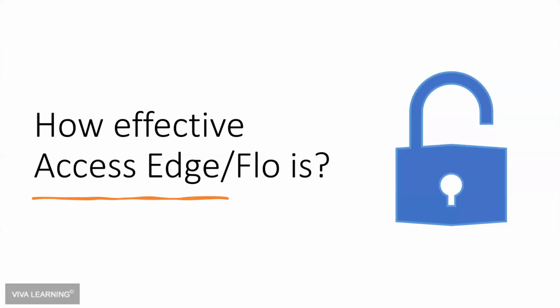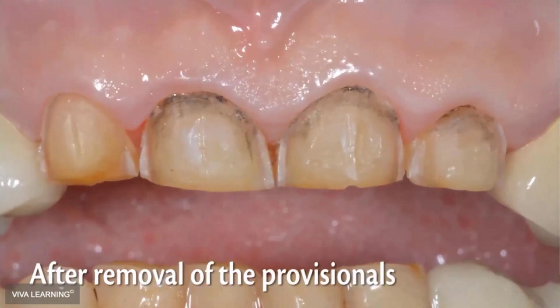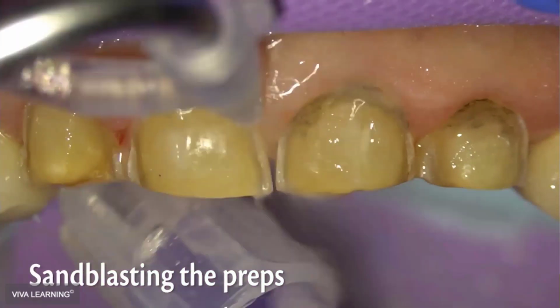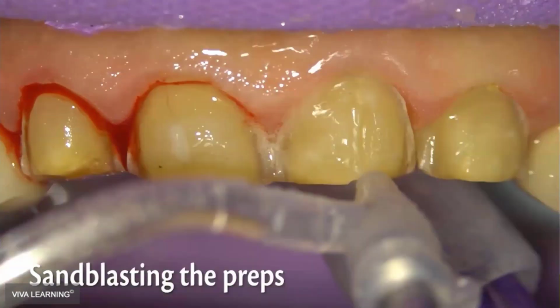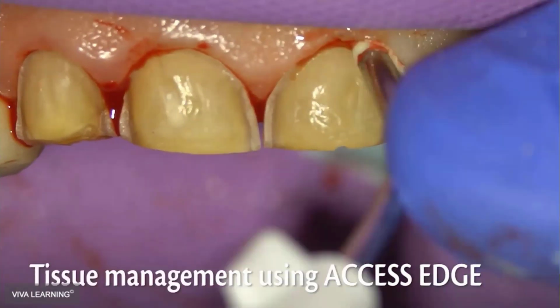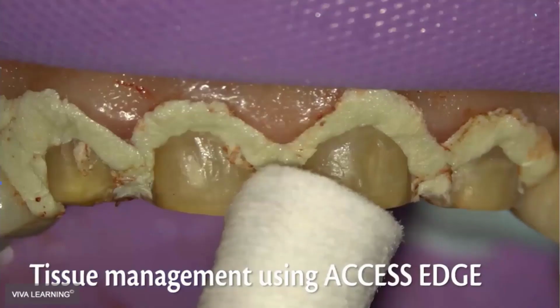Let me show you how effective this technique is. In this case, those are some provisional veneers. The patient stayed for a longer period of time. As you can see there, it's bacterial infiltration. We took an initial intraoral scan. We are cleaning the preparation with an intraoral sandblaster, and every time you use the intraoral sandblaster, you'll have bleeding. So we have to stop the bleeding in order to cement the veneers.